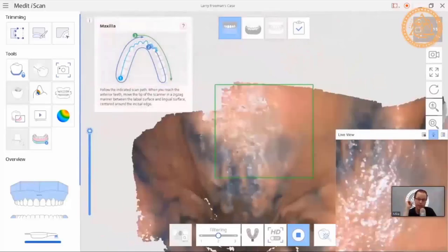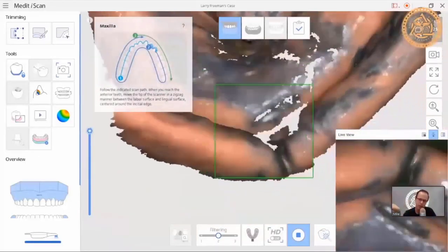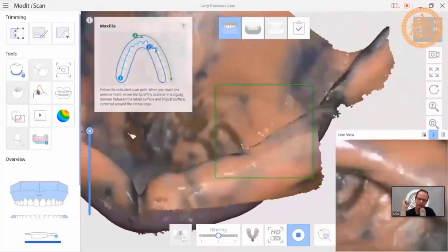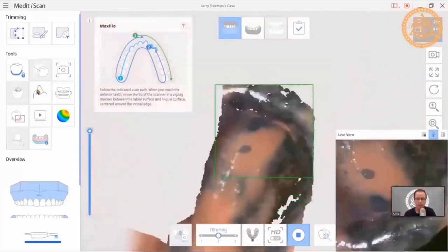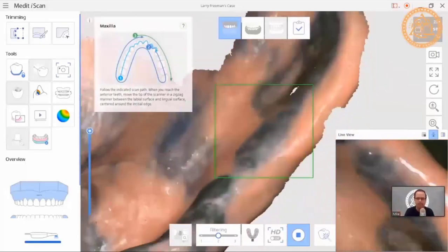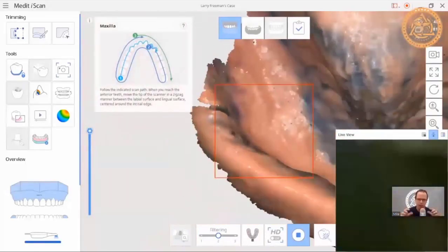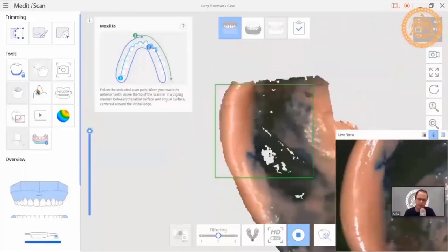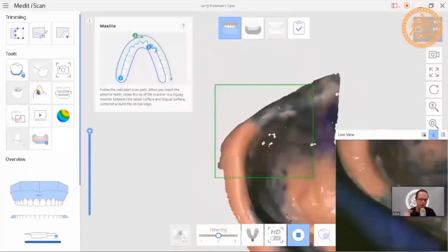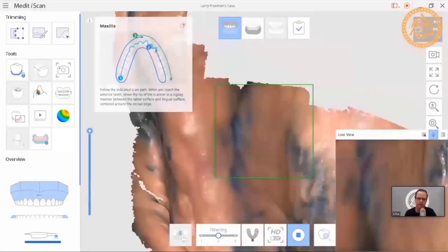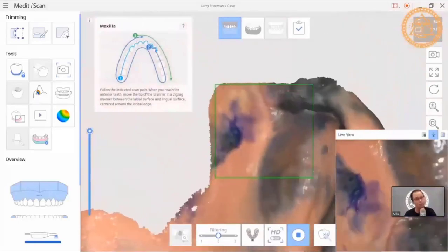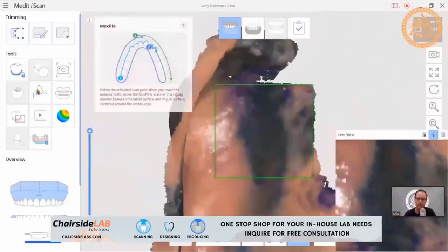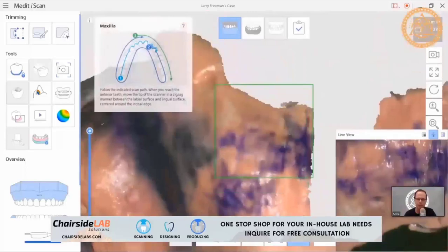Now I take out my intraoral scanner and start scanning the denture. You can scan using an intraoral scanner inside the mouth or outside. I'm scanning the impression side using in this case a Medit i500. You can use a Trios, Prime Scan, or CareStream. iTero can be done with some effort. For the most part, Trios, Medit, and Prime Scan are the go-to scanners that can do this.